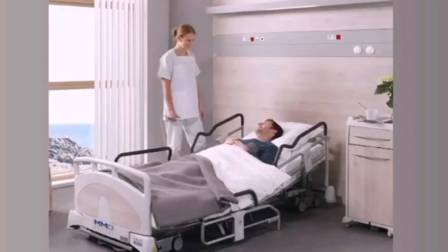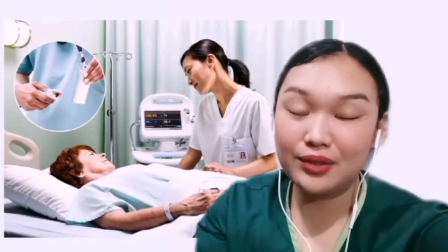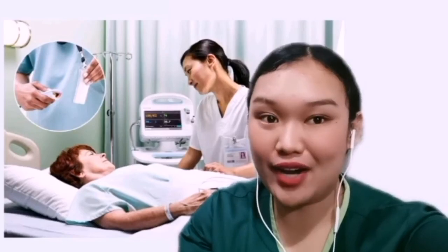Remove gloves, assist the patient to a comfortable position, raise the bed rail and place the bed in the lowest position. Remove and discard the used PPE and don't forget to perform hand washing. Reassess the patient's respiratory status, including respiratory rate, effort, oxygen saturation, and lung sounds. Lastly is to document all the procedures and all the observations on the client chart.